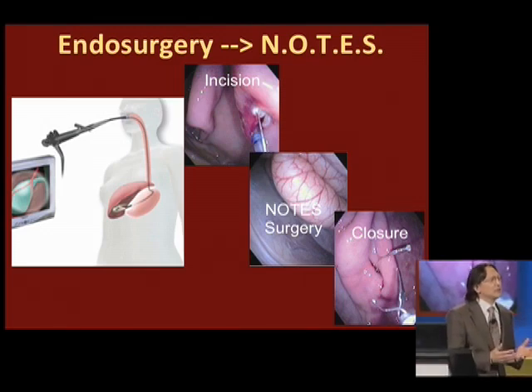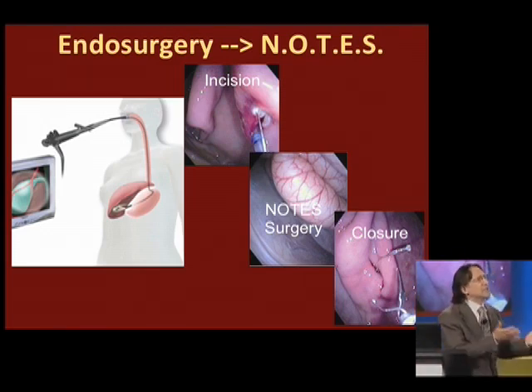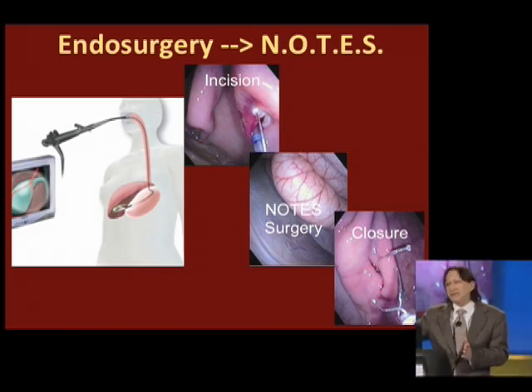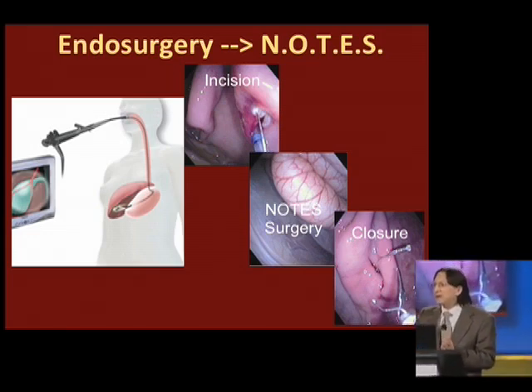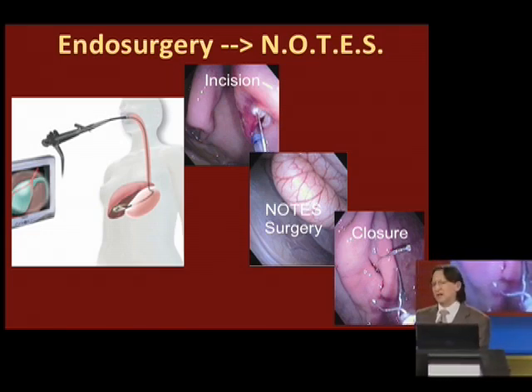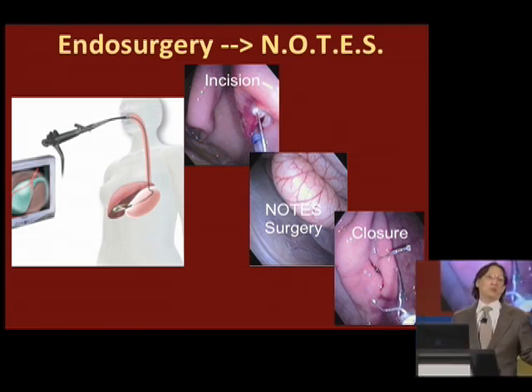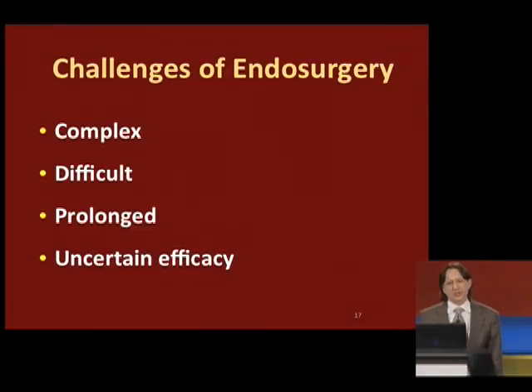And of course, if we can do surgery in the gut lumen, then why not take it outside of the gut and do surgery in the peritoneal space, laparoscopic surgery? Why not do a cholecystectomy or appendectomy? That's NOTES. So there was a natural evolution to NOTES.